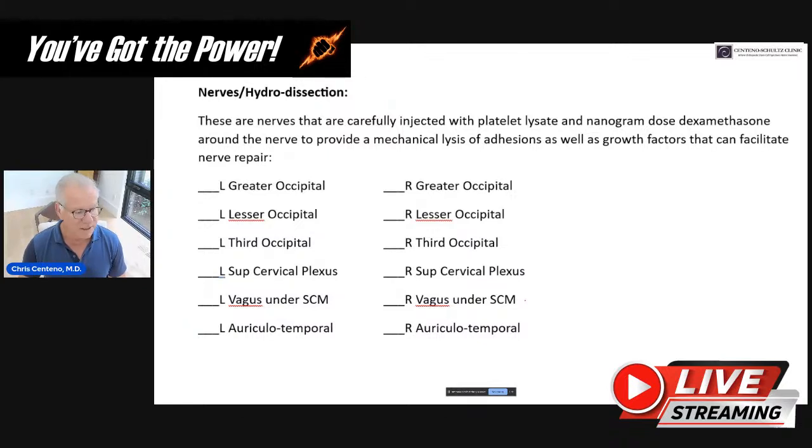And one of the ones, these two here, I'm just going to call out right away. So what's being done there is we've got the sternocleidomastoid muscle that we can see on ultrasound imaging. It looks like that under cross section, and that's this big muscle up here, remember.